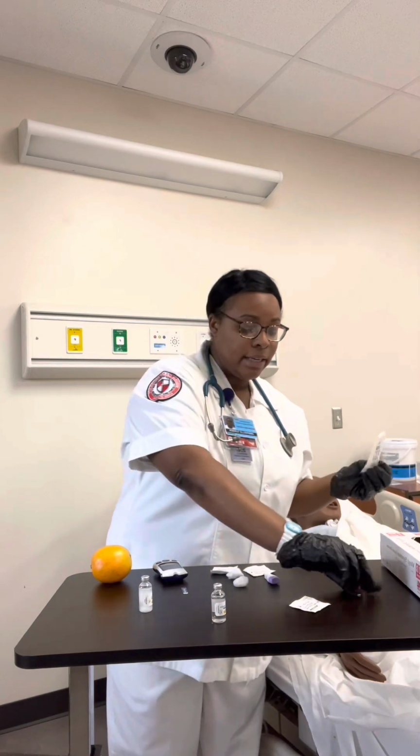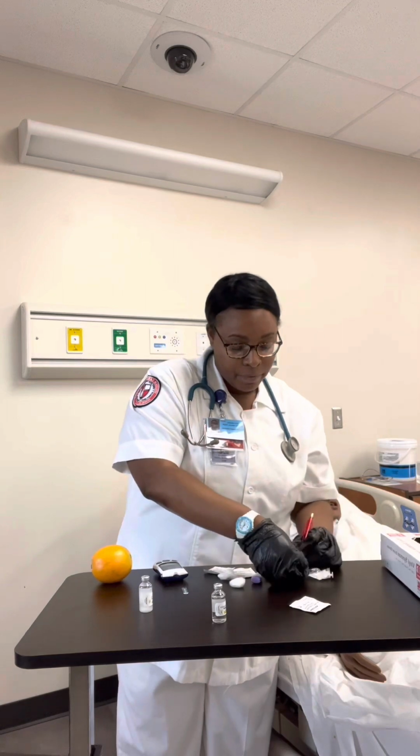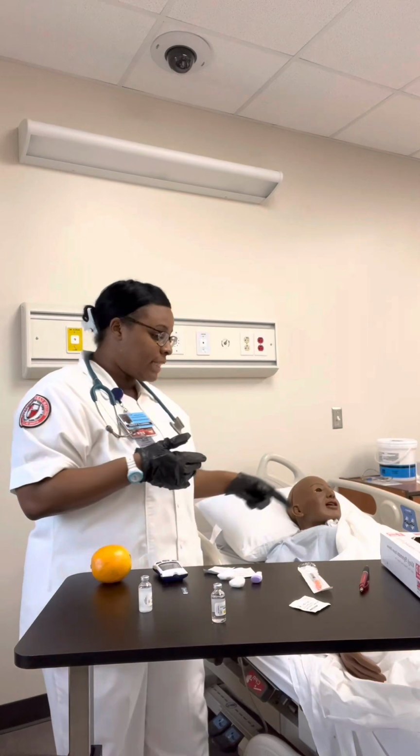And if I was mixing this outside of the room, I would label it with the client's name. But at this time, I'm at the bedside. I would then have a second nurse verify my insulin. I'll perform the third check at the bedside.